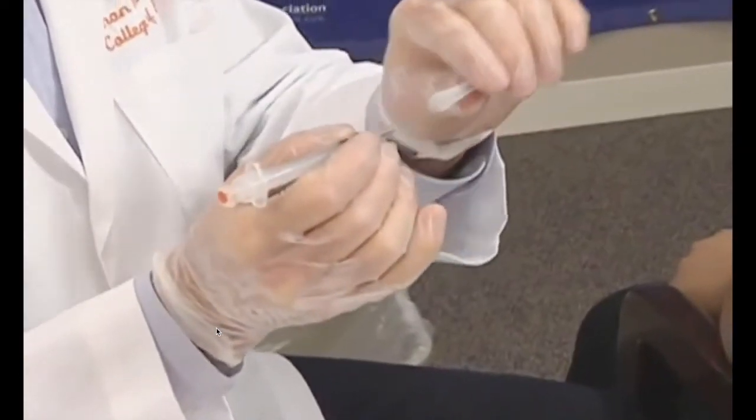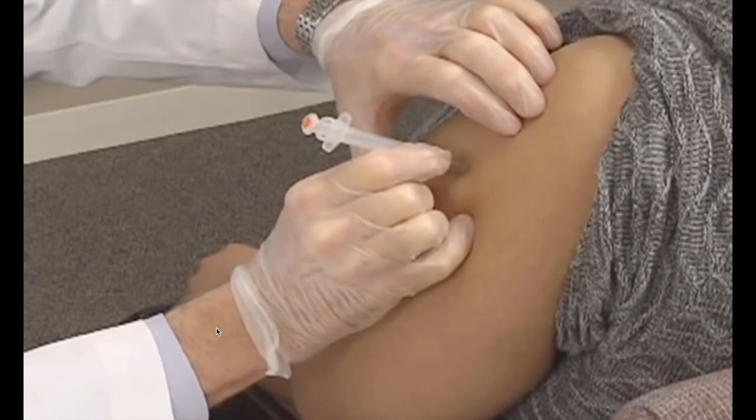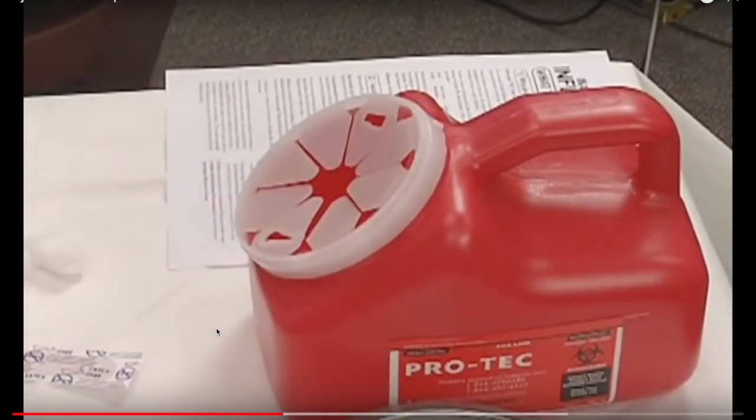Hold the syringe near the hub. Insert the needle at a 90-degree angle, all the way to the hub of the needle. Maintain contact with the patient at all times. While supporting the patient and the syringe, depress the plunger in a smooth and coordinated manner. Immediately activate the safety device. Rather than immediately activating the safety device, we will remove the needle from the patient's arm, keep our eye on the needle as we guide it to the sharps container, and only there will we activate the safety on the needle. Then we put the whole thing inside the sharps container.